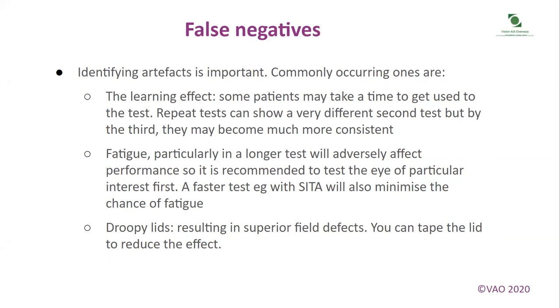Droopy lids, resulting in superior field defects. You can tape the lid to reduce the effect.